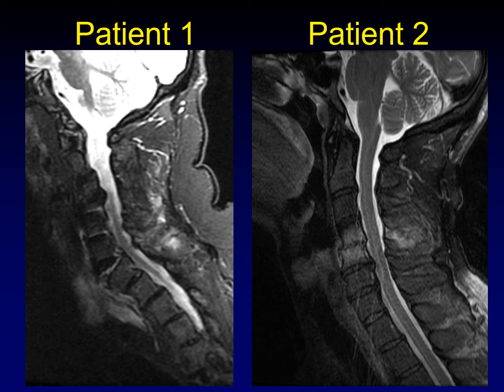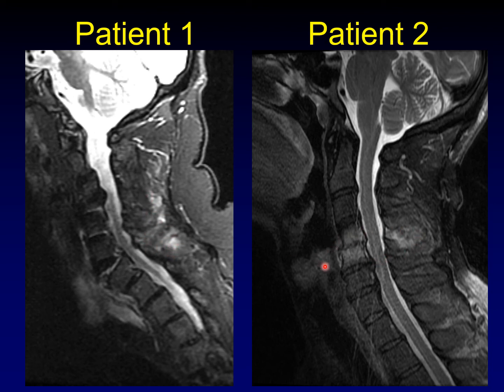Going back to the sagittal T2-weighted images, this is a classic traumatic ligamentous disruption. The anterior longitudinal ligament is disrupted. We've got a fracture line through the disc space, and we've got disruption of the posterior interspinous ligaments here.